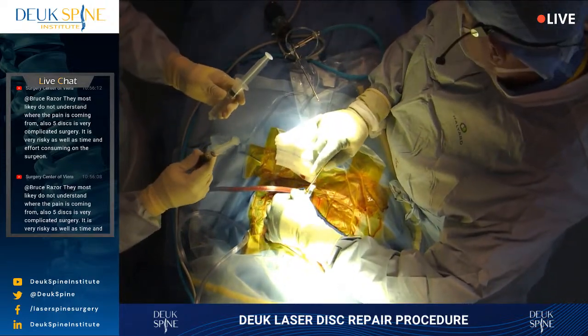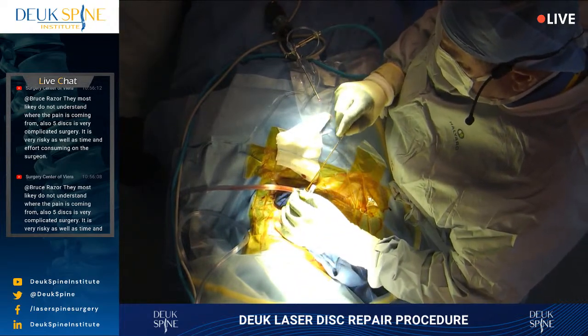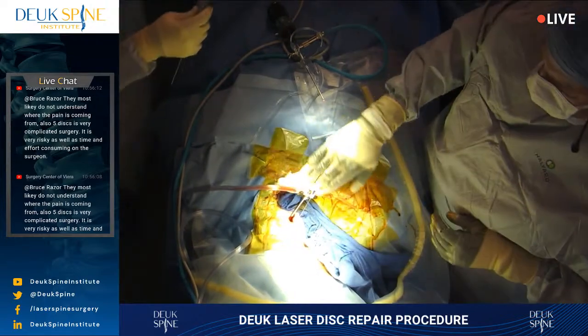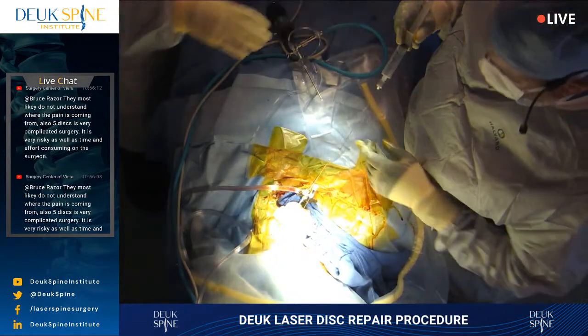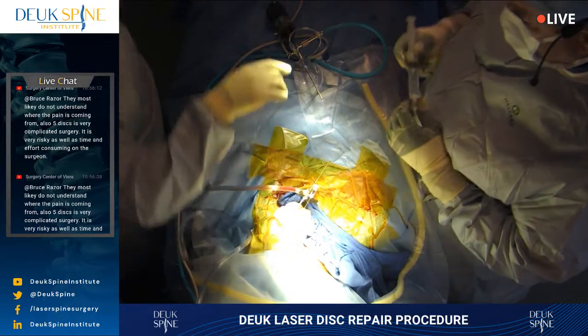I need the needle on that irrigation. Yeah. So the medical community around the world believes that neck pain is not curable, that surgery is not the solution. There is no way to fix neck pain with surgery. I don't think that's the right one. It's the other one. Right?